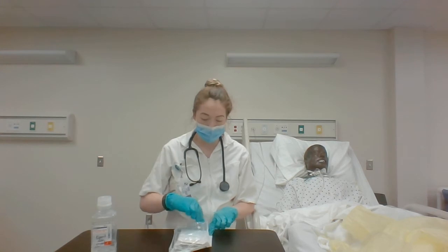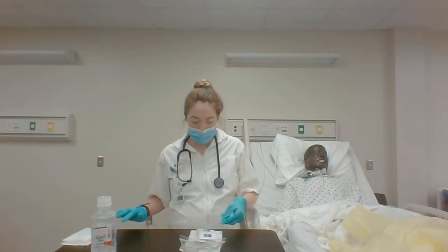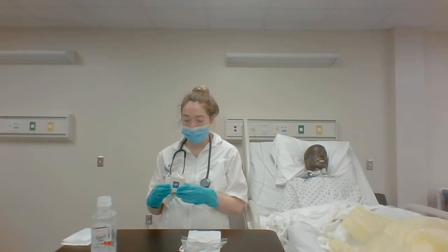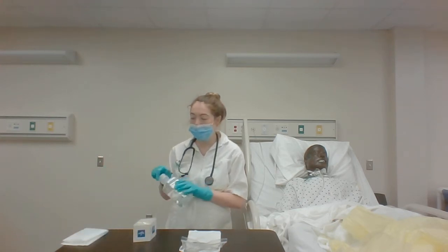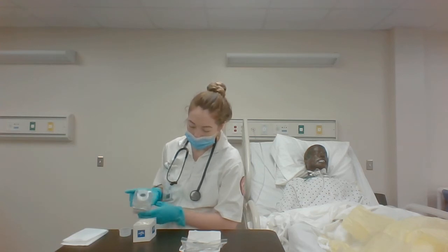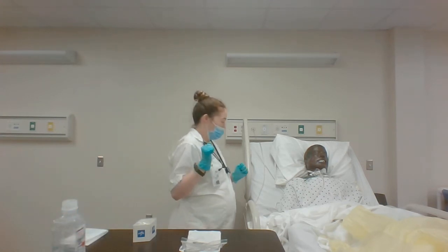After putting on clean gloves, I'm going to open my sterile kit away from me, take out the sterile gloves and set them to the side. Then I carefully open the bottom of my container, take my sterile solution, cover the label, lip it into the trash can, and gently pour it into my container.